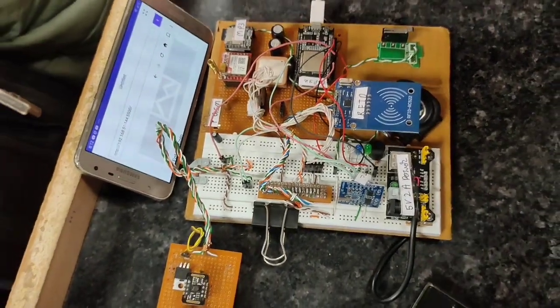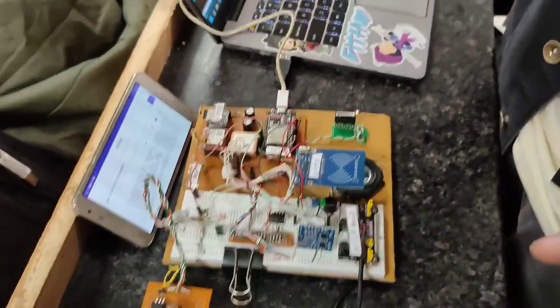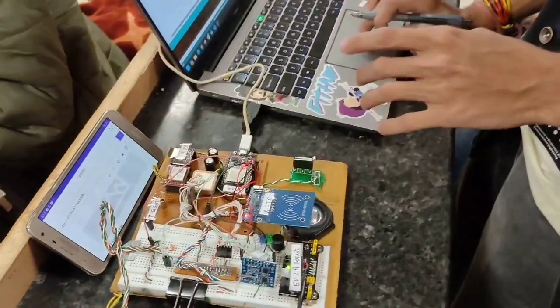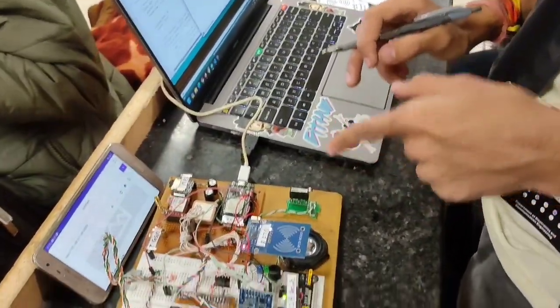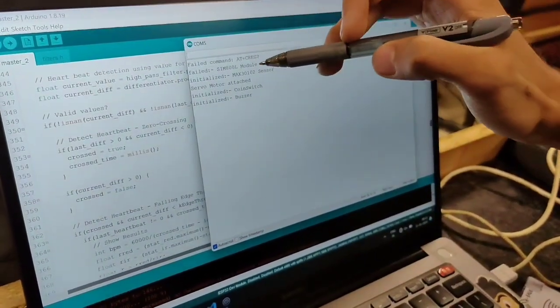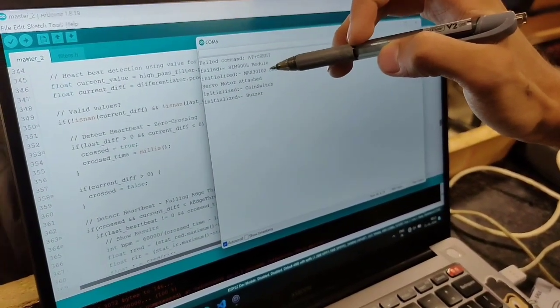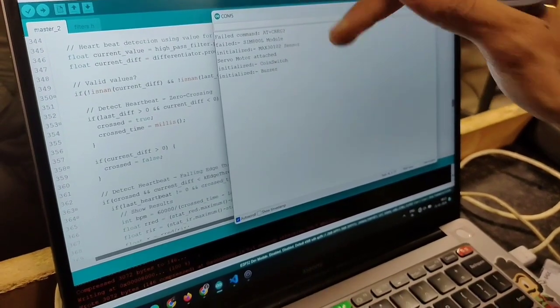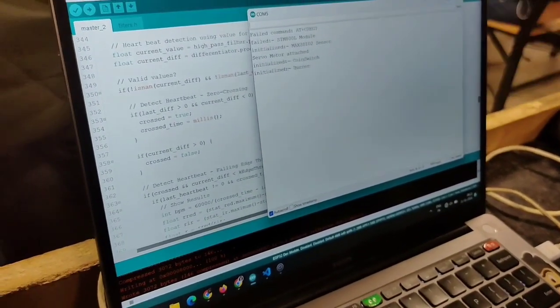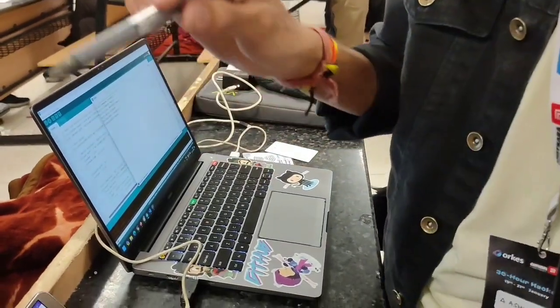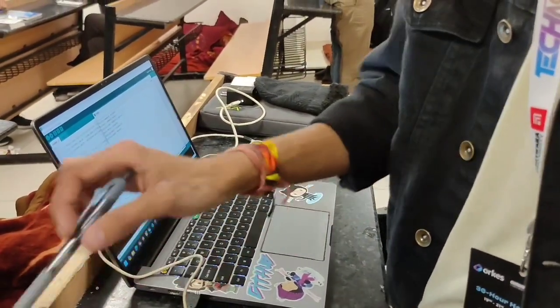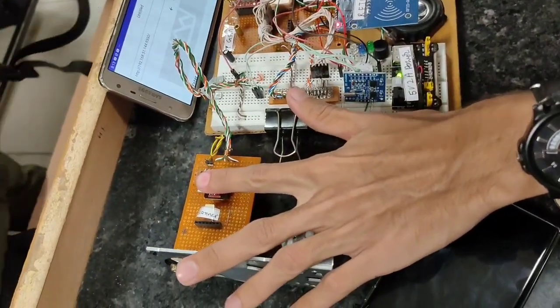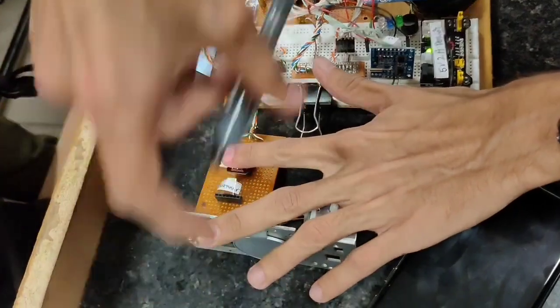I can show you an example of that. Let's test it right now. As you may see, everything is initialized - the sensor, the coin switch, the buzzer, and everything is set up now. Let's assume it was a new user who entered his data on the display and everything is ready. He'll place his finger here.